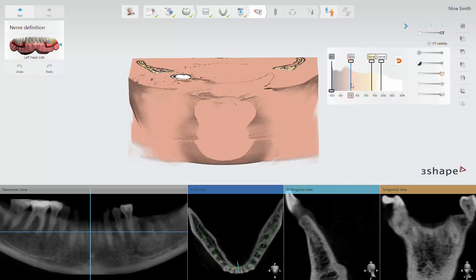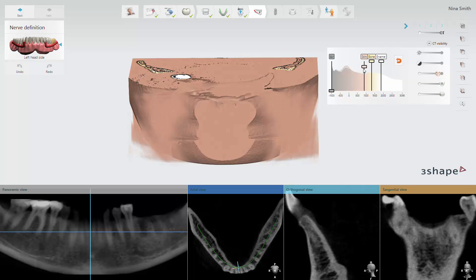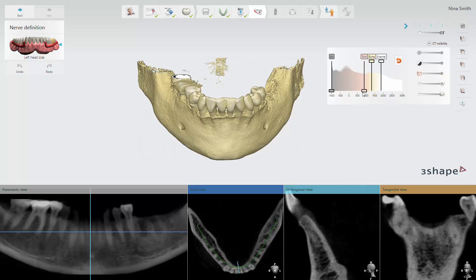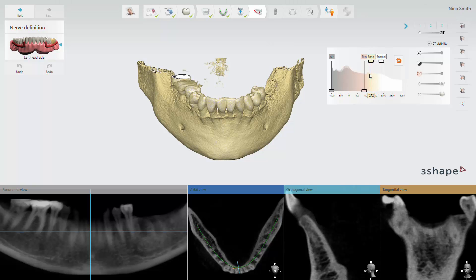To improve the CT scan visibility, start by moving the air and skin sliders down to turn off the visibility of these low density materials. Then move the skin slider to the right to make sure only the bone is displayed. Now you can move the bone slider left and right to find the best bone visibility.